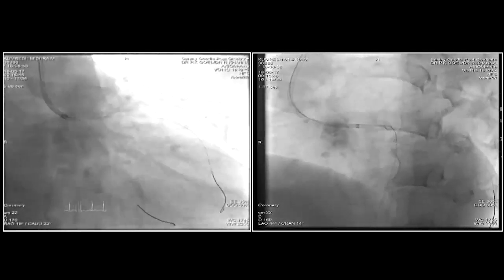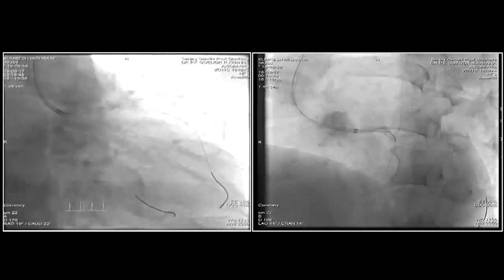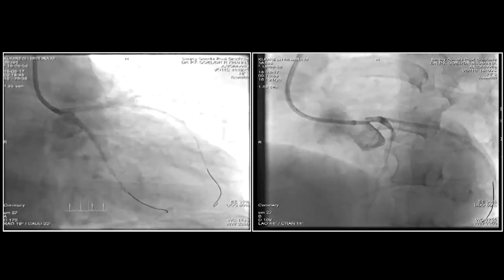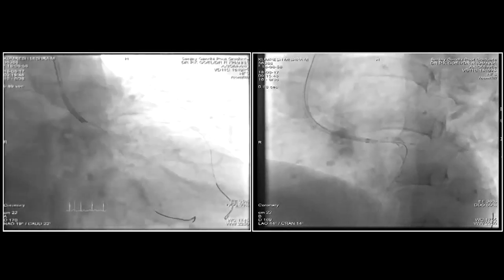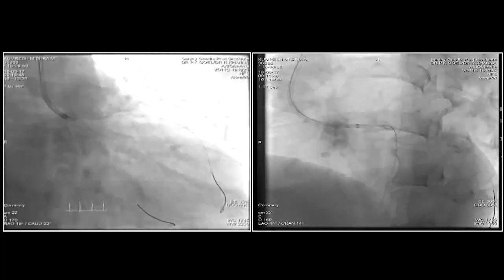Because if he wants, he can take out the wire and finish it off. I think before putting in the POT, ideally you rewire it too. Before the proximal optimal dilatation, you really require the wiring into the circumflex, and then it is always convenient. No, no. If you wanted to go ahead, you can do it.